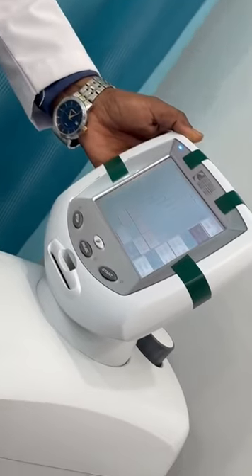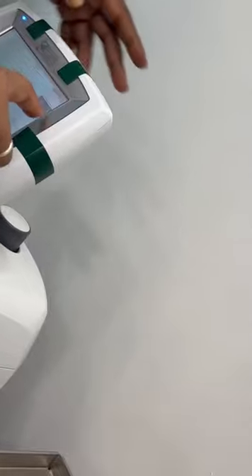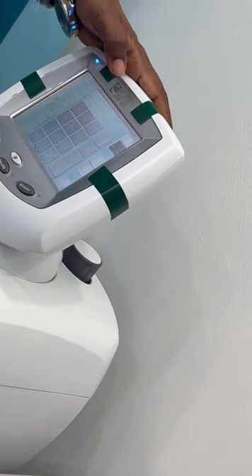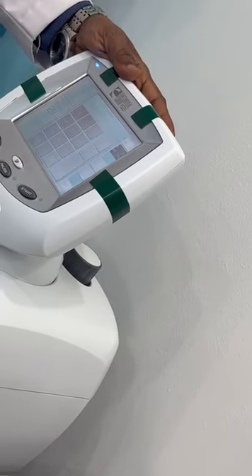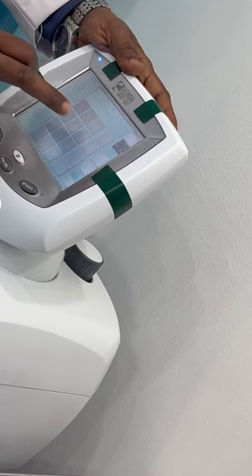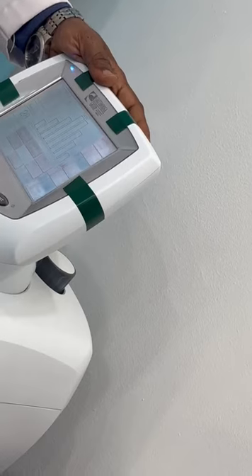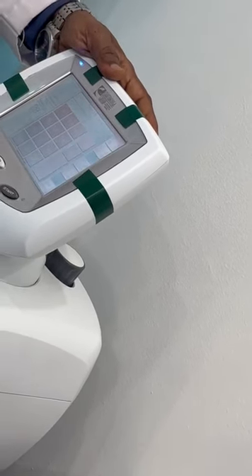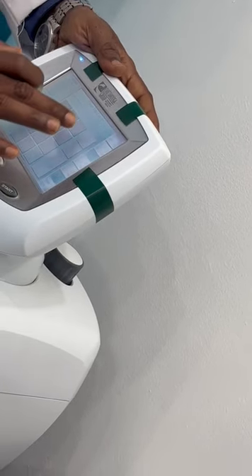The maximum level weight and minimum level, how much can I keep? For example, for cervical traction I am keeping 7% of the body weight. So for example, I am keeping 5 kg for the maximum. Minimum, you need not bring it to 0. I will maintain almost 3 kg.